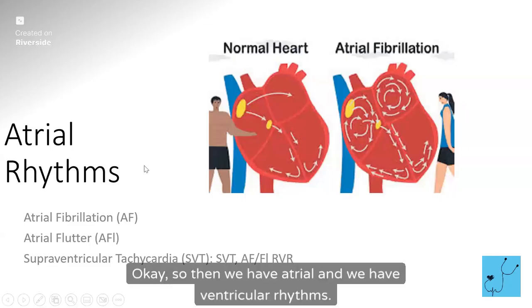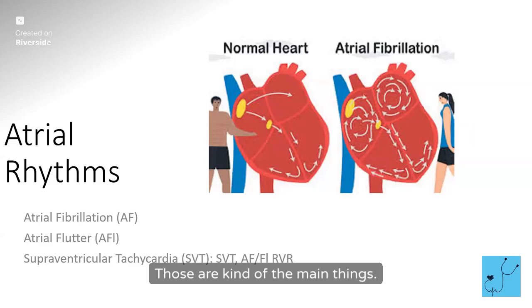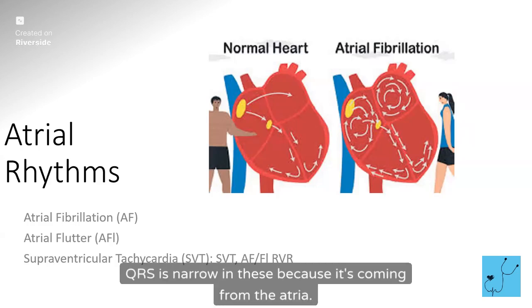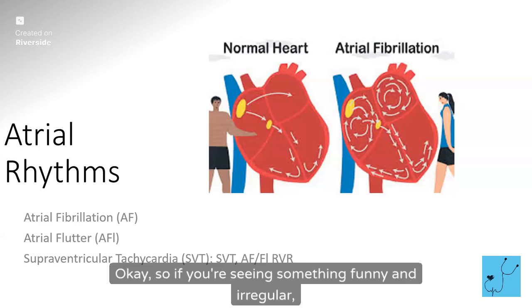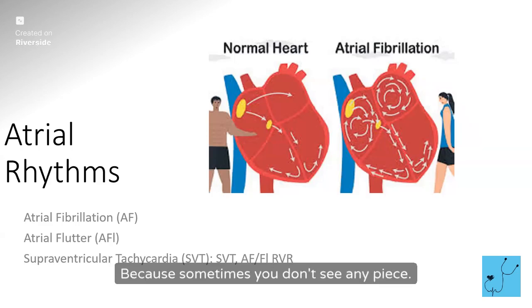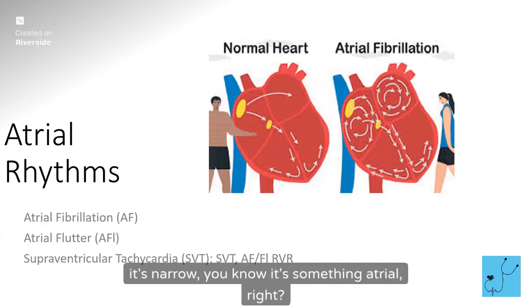Okay, so then we have atrial and we have ventricular rhythms. So the atrial rhythms are pretty much AFib or A flutter. Those are kind of the main things. How do we differentiate AFib and A flutter from some of the ventricular rhythms? The QRS. QRS is narrow in these because it's coming from the atria. So if you're seeing something funny and irregular and you're trying to decide what you're looking at, because sometimes you don't see any P's, sometimes you see a bunch of P's, it's kind of hard sometimes to tell. That QRS, if it's narrow, you know it's something atrial.